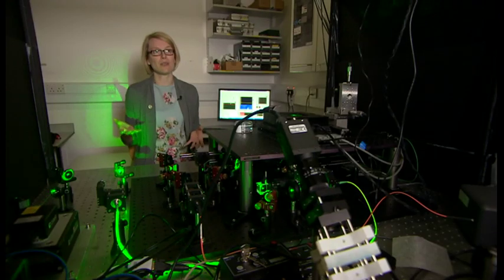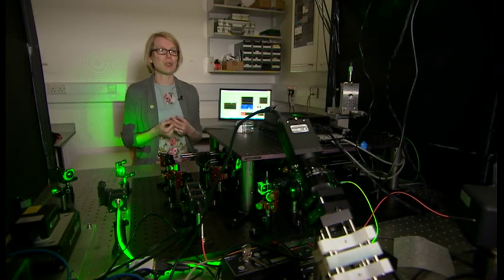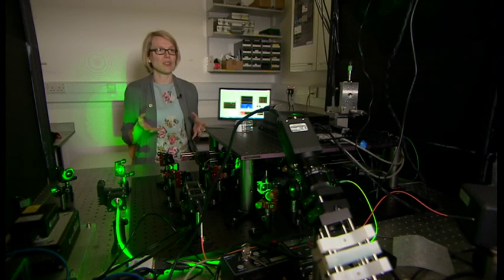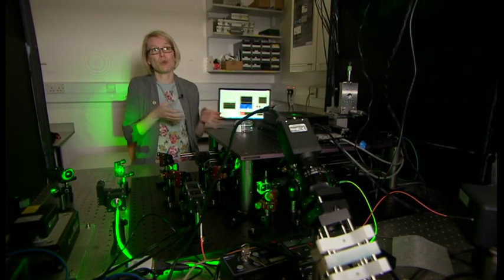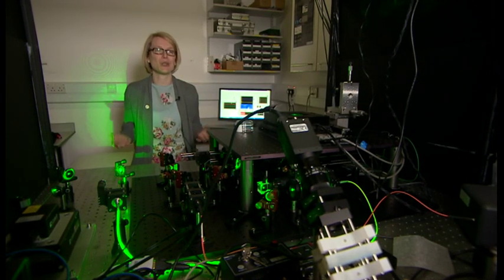The current camera looks down the throat using white light, and that makes it quite hard to spot the cancer. The new camera is going to look using different coloured lights, and if they get the right colour, it should make the potentially cancerous cells glow. What happens as the tissue becomes cancerous is that you get a change in the chemical composition, and different chemicals have different colours, which means that if we look at the cancer with a technique that allows us to capture information from all of the different colours of light that are being reflected, we can get a fuller picture of the disease state that's present. And this is how it might look.